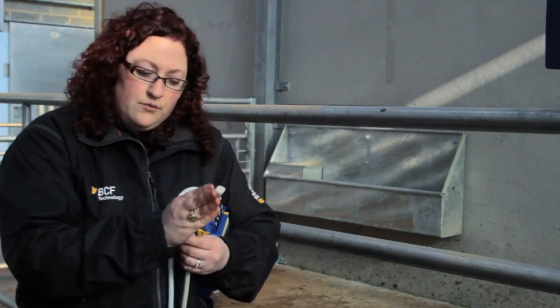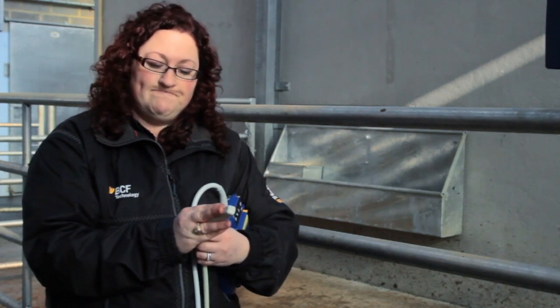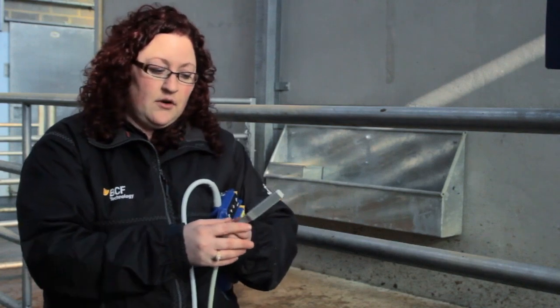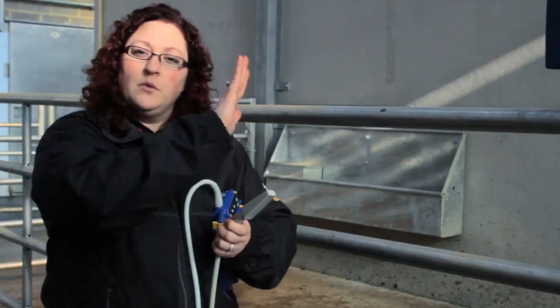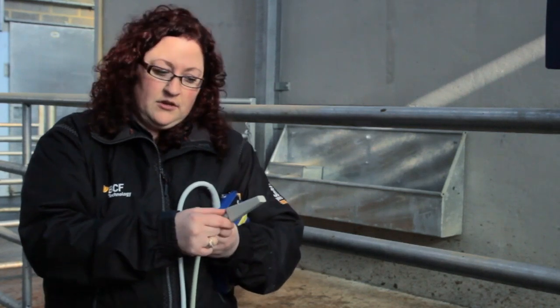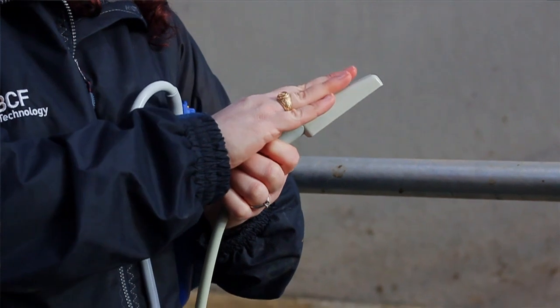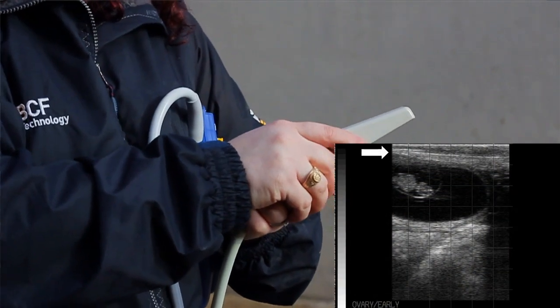Therefore, you need to understand how to hold the probe to get the best possible image of whatever it is you're wanting to look at within the cow. A few features that you need to recognize are where the tip is and how that relates to what you're actually seeing on the screen. On this particular machine, this probe, the tip is located to the left side of the screen.